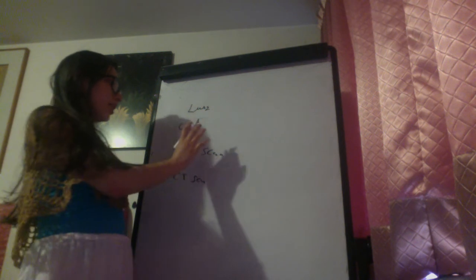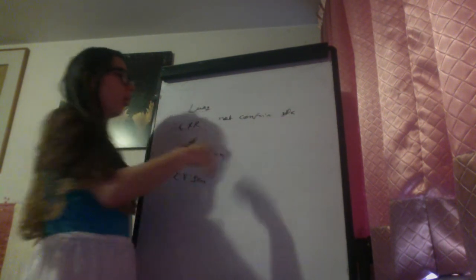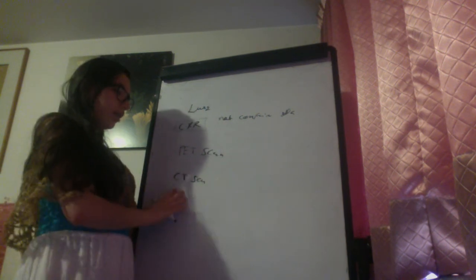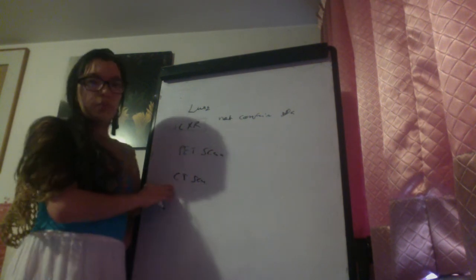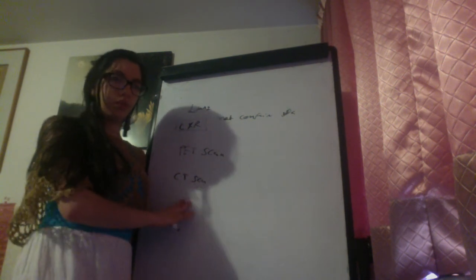The chest X-ray is not used for confirmatory diagnosis, for example, of cancer or nodules, etc. The CT scan has more sensitivity than the chest X-ray sometimes, and is less affected by movement of the patient.